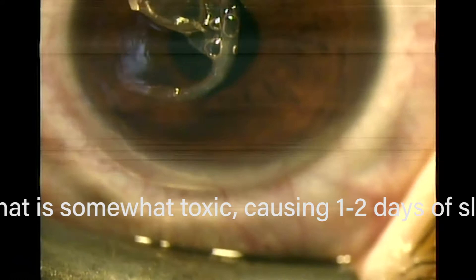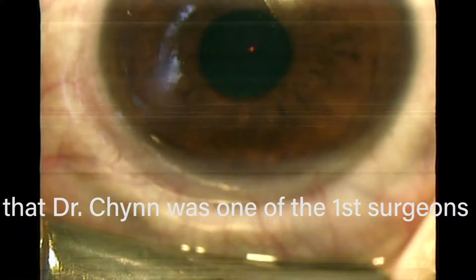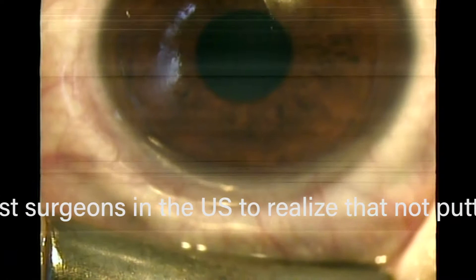I'm just waiting for this patient to stop looking around so I can take the skin of his eye off. You can see the skin is basically heaped up in the center. I'm going to go to high magnification to see a little bit better. It's a little de-centered, but it's a very quick process. That little instrument I used was a spatula — we call it a spatula because it's blunt, like the separator, so it can't go into the cornea.